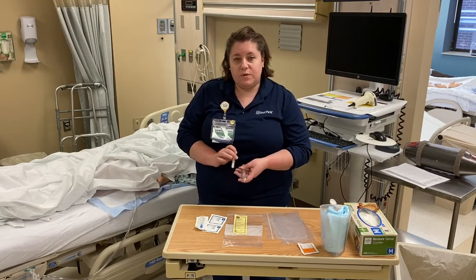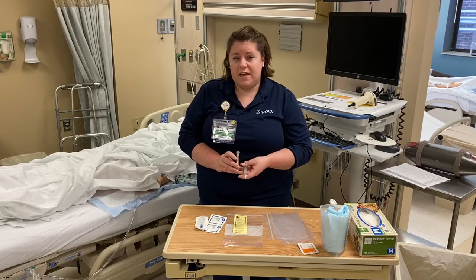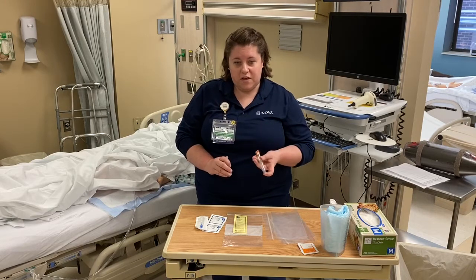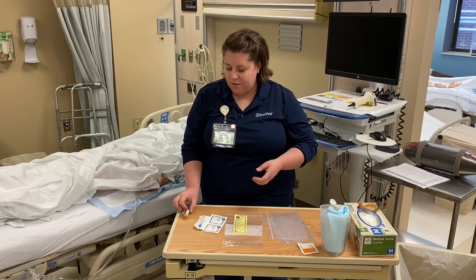Since the gray tube is for the bacteria, the specific bacteria, I want to make sure this doesn't get contaminated, so I always draw this first. So, gray tube first, then your red and yellow. So I'm going to set them up in the order of the draw on my bedside table.